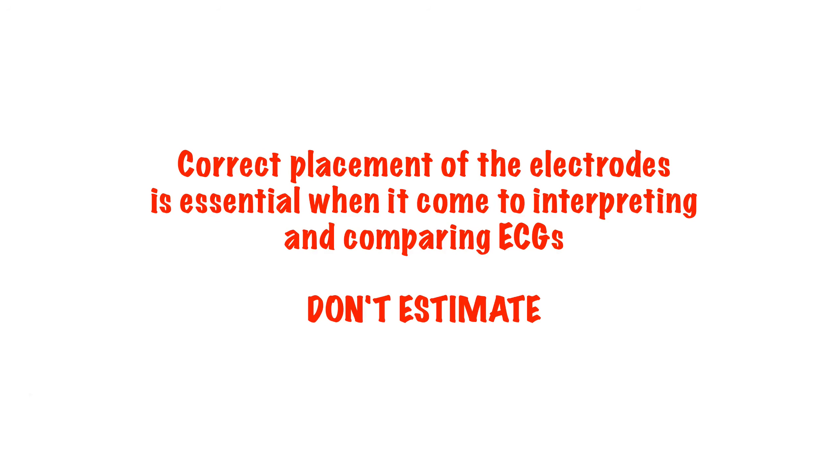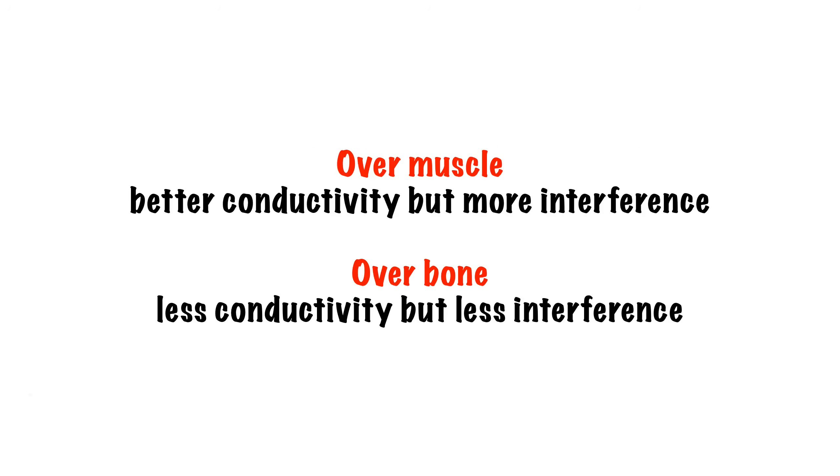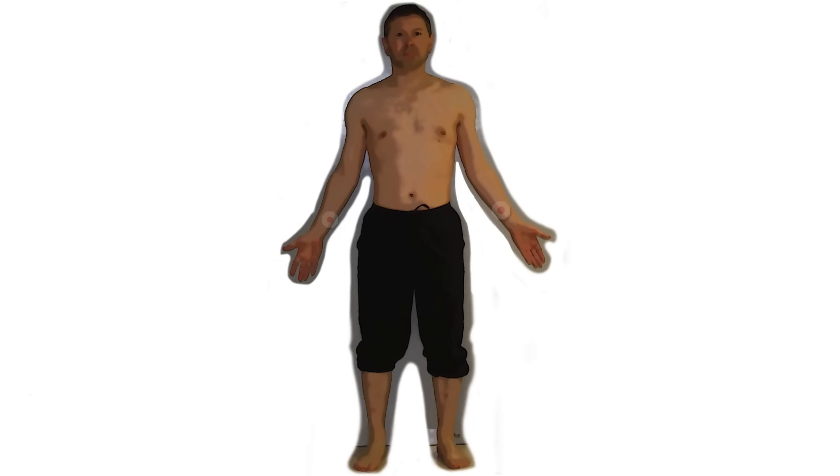Next, you need to find your landmarks and place your electrodes. Start with the limb leads — one sticker for each limb. Debate exists as to where exactly you should put these electrodes and whether it should be over bone or muscle. I personally tend to go with the inside of the forearm over a bony prominence to limit muscle interference. However, if the patient is tremulous, I would move more proximally to limit interference caused by the tremor. For the lower limbs, I just tend to use the medial aspect of the lower half of the tibia.